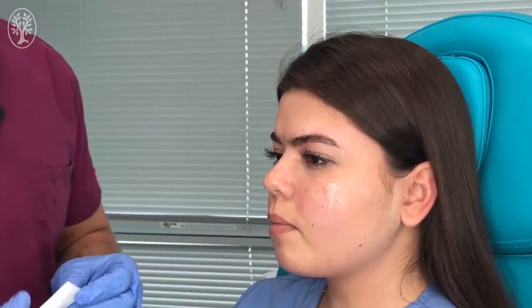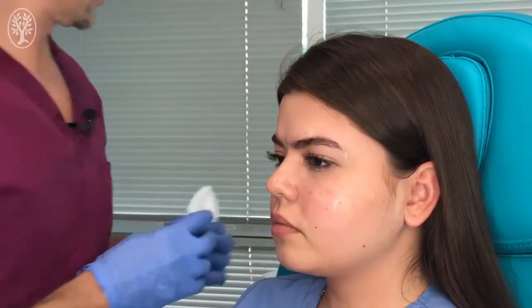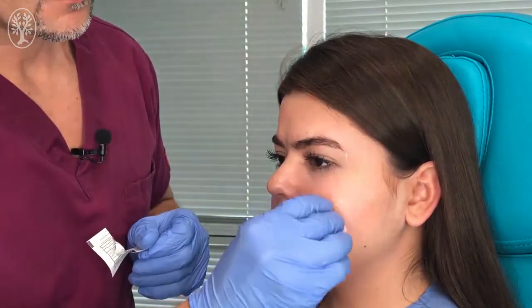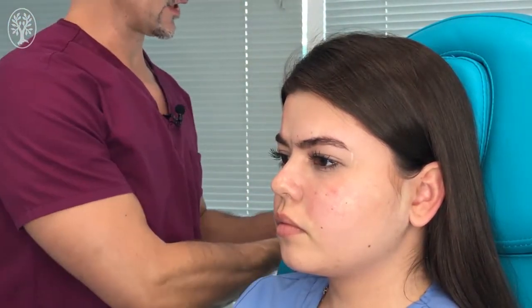Once 15 minutes have passed, we're going to clean the excess EMLA cream and then clean the skin before proceeding to the injection.